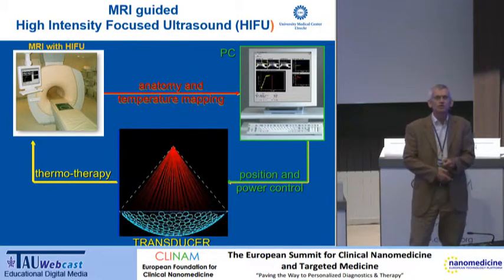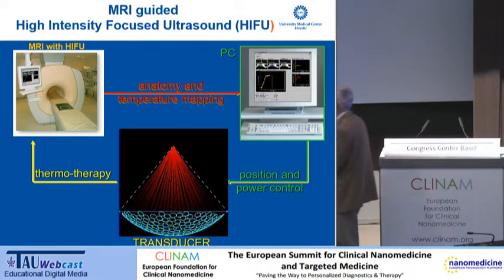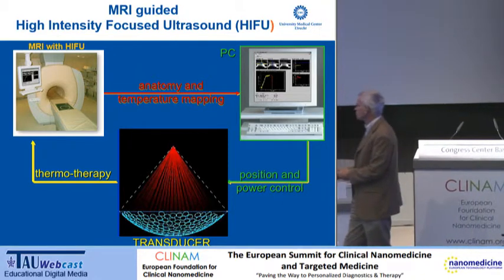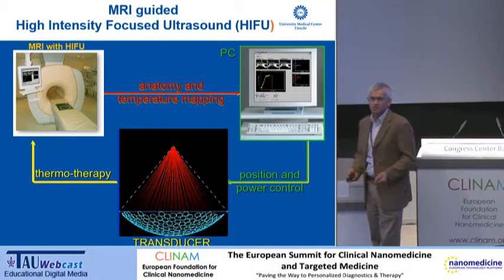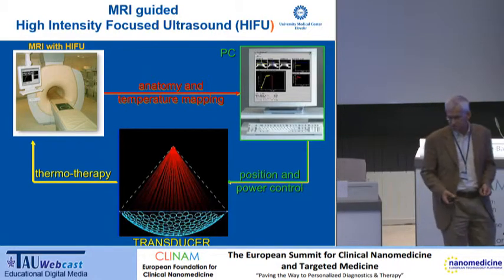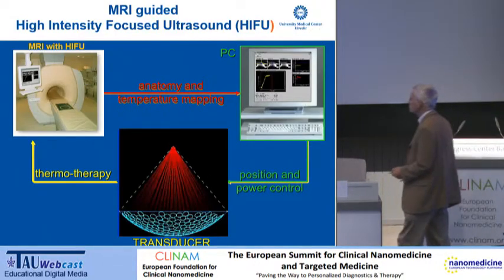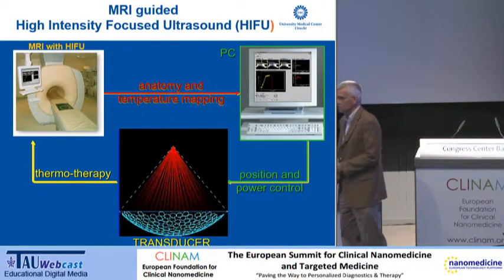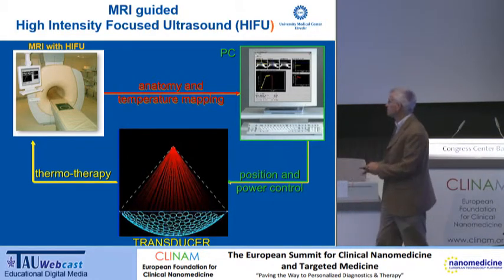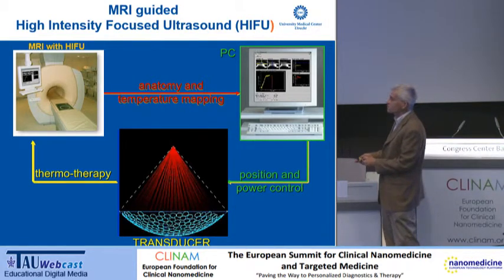So this is not your ultrasound imaging, where you interrogate a very wide region. This is really focusing all the waves in one spot, and this works very similarly to an optical lens, the focusing of optics into a focal point. Now, what are the dimensions of this focal point? It has to do with the wavelength. The wavelength that we are using here is about 1 millimeter, and the dimension is of the order of 1 millimeter.